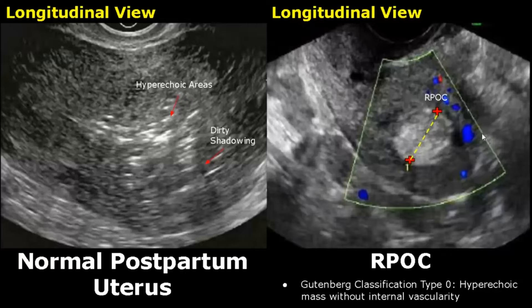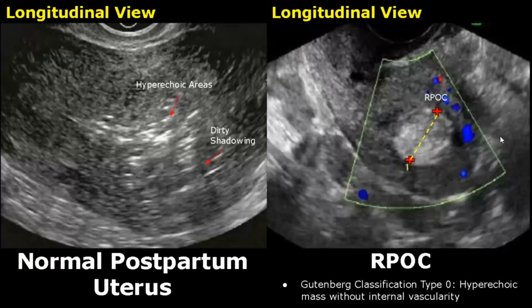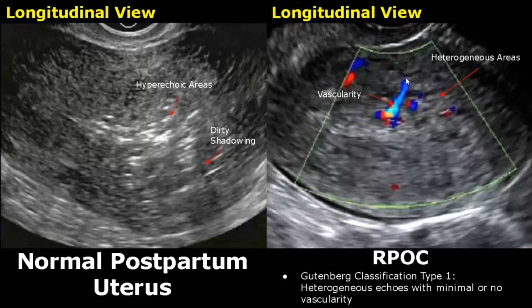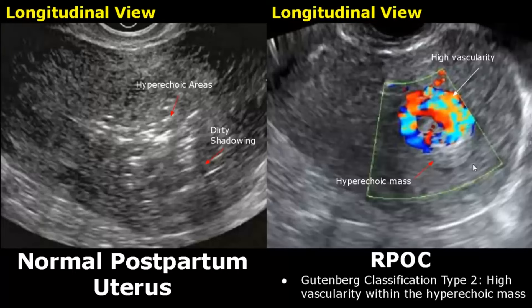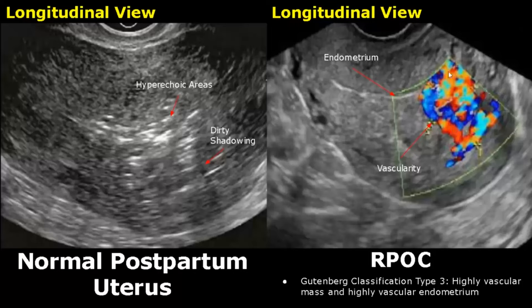RPOC can be classified based on Doppler analysis — this classification is called the Gutenberg classification. Type 0 RPOC is a hyperechoic mass without any internal vascularity and no Doppler signal within the mass. In type 1 RPOC, heterogeneous echoes with minimal or no vascularity are seen. In type 2 RPOC, high vascularity is seen within the hyperechoic mass with no blood flow outside the mass. Type 3 RPOC has a highly vascular mass and highly vascular endometrium with large blood flow seen within the mass and in the endometrium.